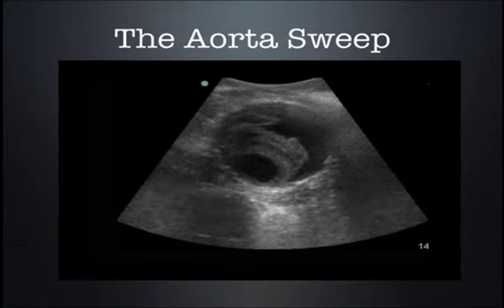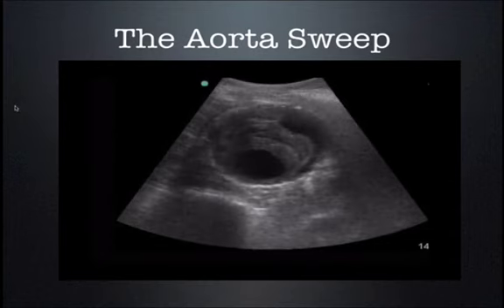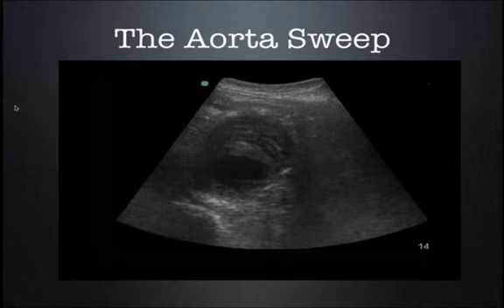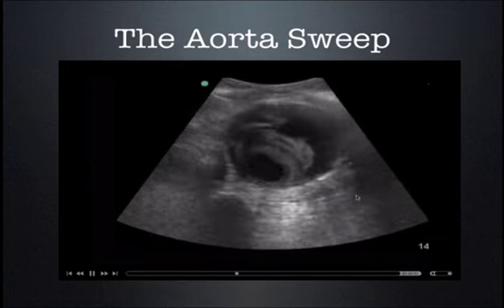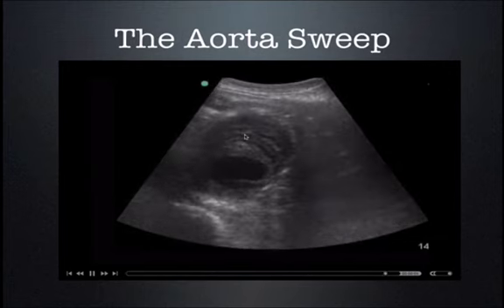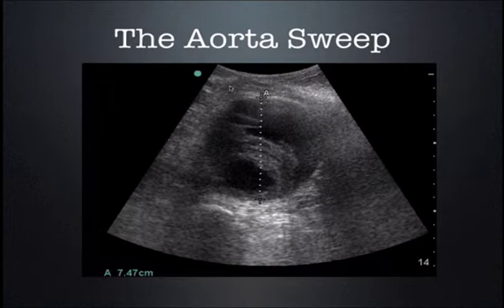Now, if on the other hand you see this, this is an abdominal aortic aneurysm. In a hypotensive, unstable patient who your gestalt is high for ruptured AAA, this is AAA. You assume it's ruptured. We don't see any free fluid. We don't care about that. This is in all likelihood a ruptured AAA. You call vascular surgery. This here is showing how to measure an AAA.